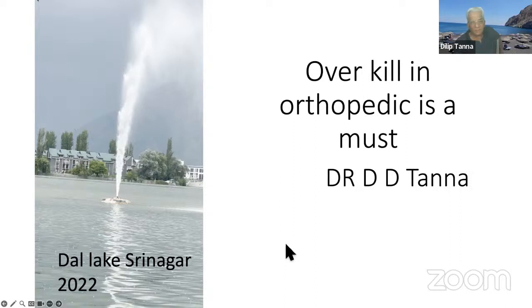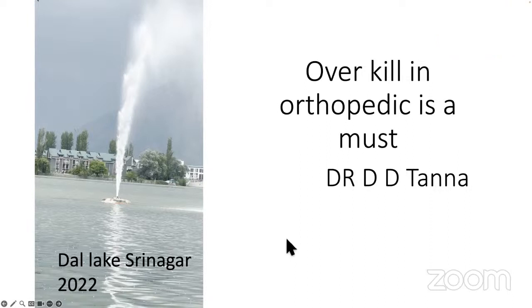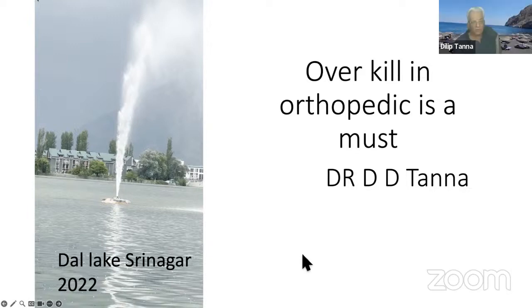Any other questions before we go further? Sir, any inputs on osteoporotic shaft fractures, static locking, distal locking pertaining to that? Osteoporotic is the issue: even if you put in a 12 number nail, and at times even a 13 number nail, still it is not tightly fitting. And then you have an issue.